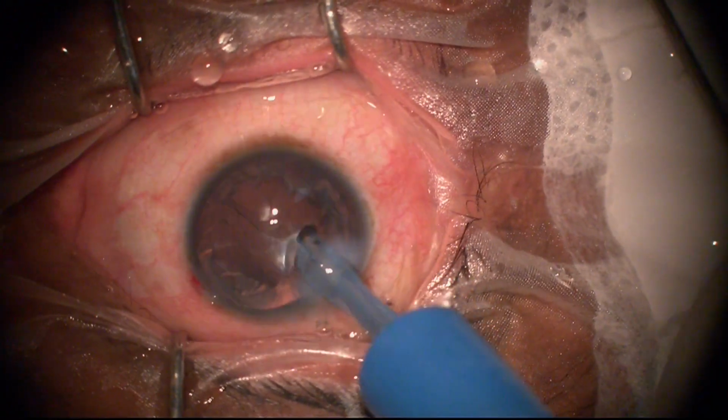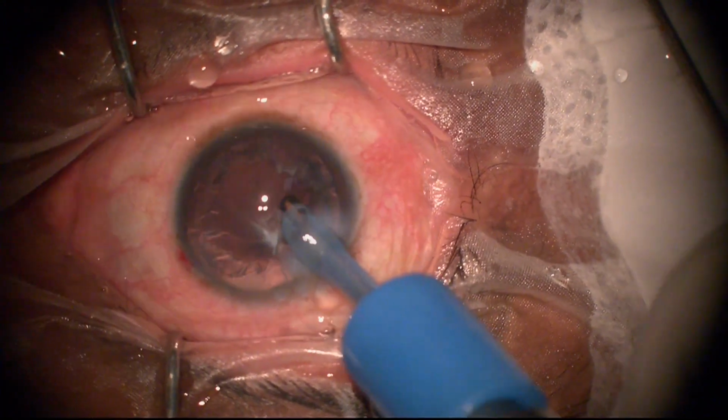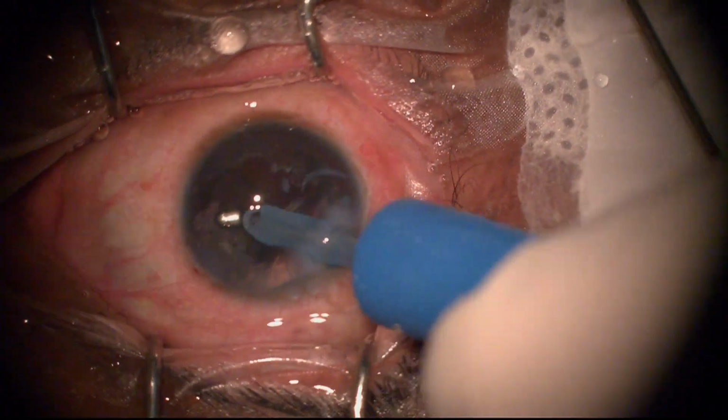He is a very uncooperative patient. Although I have to push the eyeball down, and then only he is maintaining that gaze. Also moving his head.